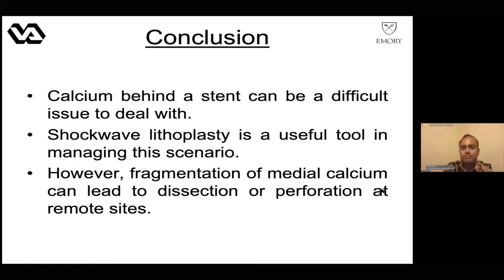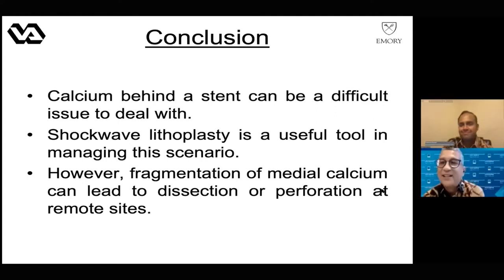So I think there's many things that can be discussed in here. We still have 10 minutes for discussion. I believe that Gautam already chose shockwave lithoplasty in this difficult scenario. What about in Japan, Dr. Sugi? Do you do lithoplasty or shockwave in this kind of situation?